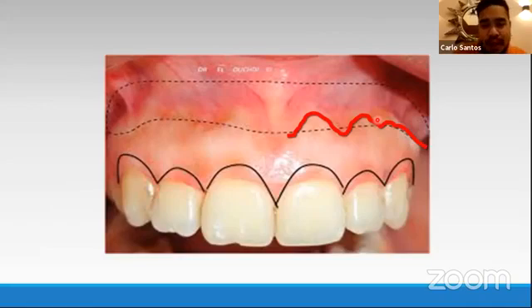So again, the incision will be here at your mucogingival margin. You make two incisions. There are two types of techniques in doing lip repositioning. One includes the frenum, that's your standard lip repositioning, which also deals with the frenum and does a frenectomy. But personally, I don't like touching the frenum because, number one, it's one of your landmarks. It's one of the midlines. Let's say your patient encounters an accident and his nose tips to the right or is not in the center anymore. At least you still have your frenum to guide you with your midline.